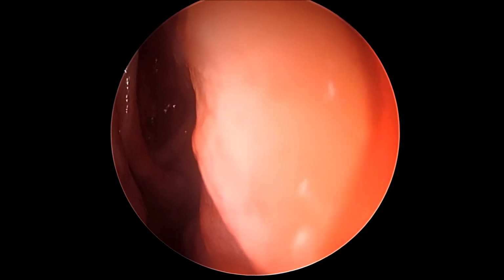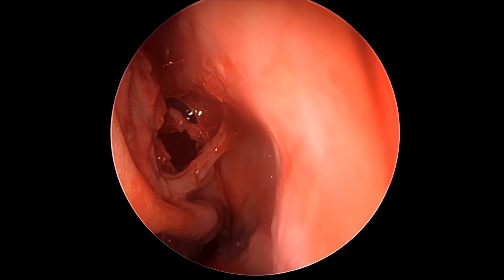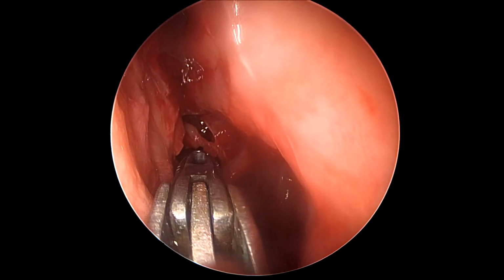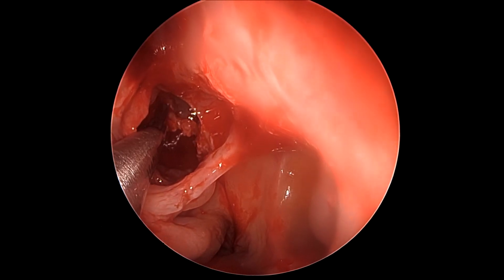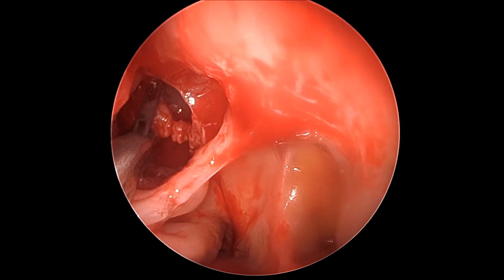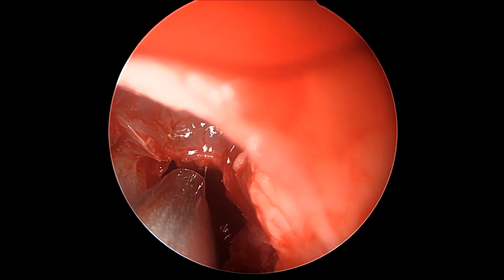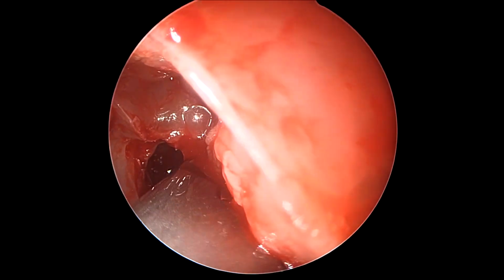Sharp cutting forceps and sharp cutting bone punches are very vital, so that one has a minimal amount of mucosal avulsion, because that leads to generally exposed bone and scarring. And some excess tissue or mucosa that does become avulsed can be transected using good quality true cuts rather than using a Blakesley forceps, which would simply avulse the mucosa and would lead to poorer outcomes in the long term.